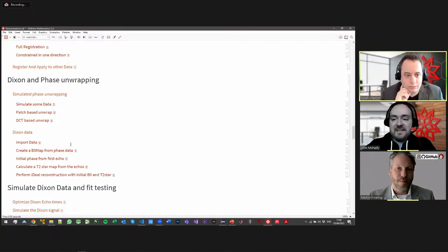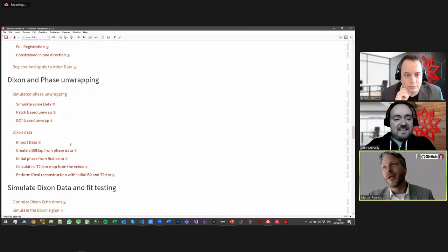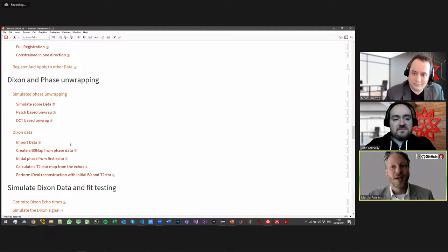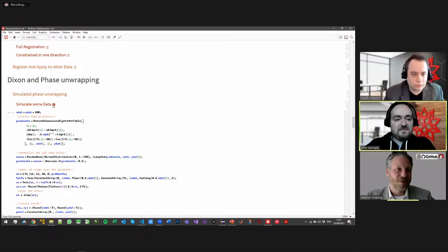That's fantastic as a feature. Yeah, so the modeling, because of the symbolic nature of Mathematica, it's quite easy to build forward and inverse models. Basically you write the code once, and then either you port it into FindFit, or you port it into a table and generate the signal with it. So that's sort of nice. I think it's also nice to show.